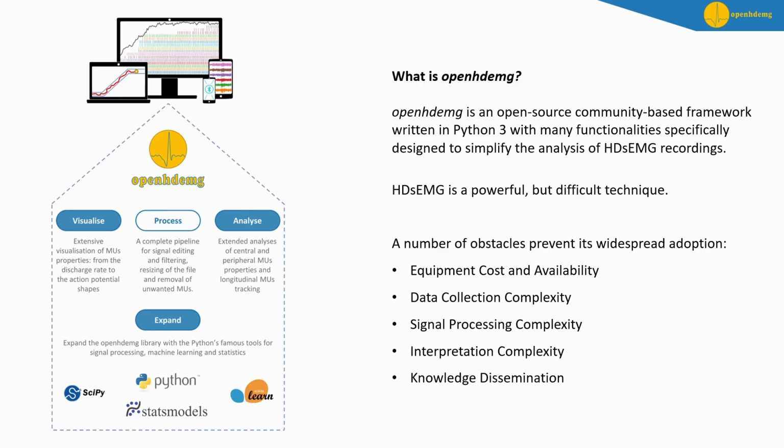Over time, as I said, we added a lot of things, and in the release that we just published a few days ago, we also expanded the analysis part with the decomposition and motor unit cleaning, so that now we can have an integrated framework with all the features that we need to perform advanced motor unit analysis.